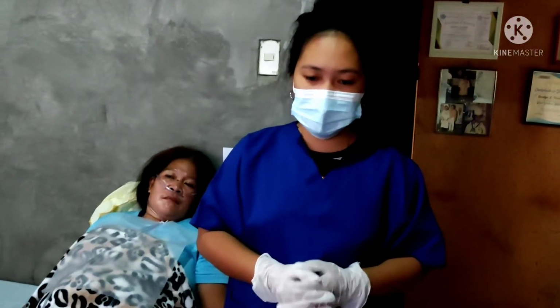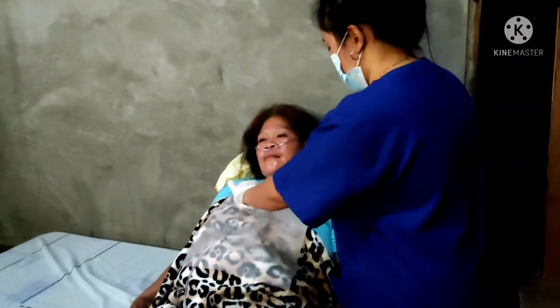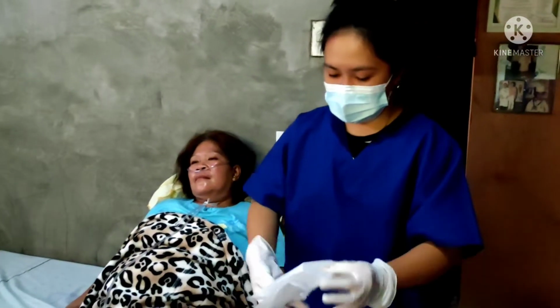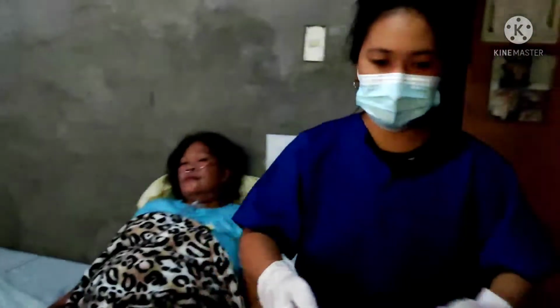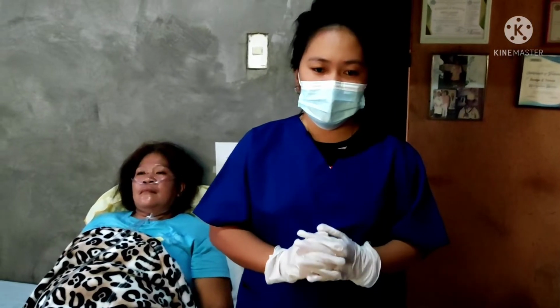Assess respiratory status and repeat the suction procedure if necessary. Then remove the drape or towel and place it into the trash or laundry if it's soiled. If she has a diminished level of consciousness, help the patient into a side-lying position to encourage drainage.